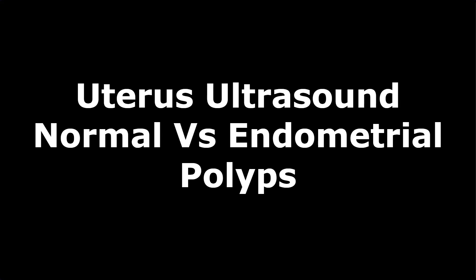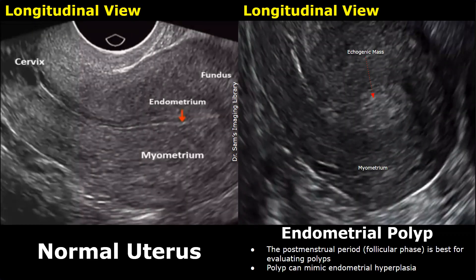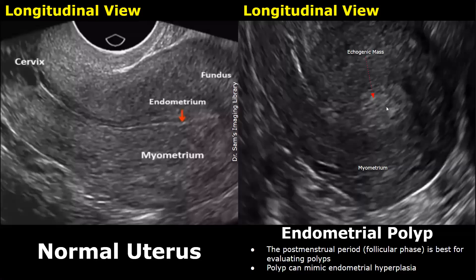Hello everyone, this is Dr. Sam, and this video is about ultrasound of endometrial polyps. We will compare the ultrasound appearances of the normal uterus with the appearance of an endometrial polyp. An endometrial polyp is a benign uterine mass which arises from the endometrium.